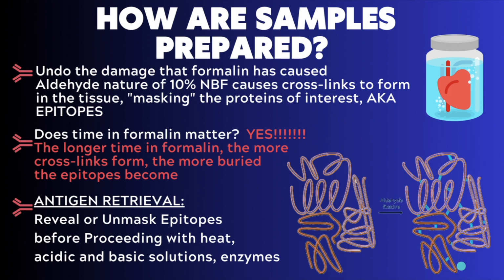You will hear this process referred to as antigen retrieval or antigen unmasking, and it can be done with heat, steam, acidic solutions, basic solutions, or even with enzymes. In the research setting, some scientists will try to debate that time in formalin doesn't matter, and that is true for some proteins.